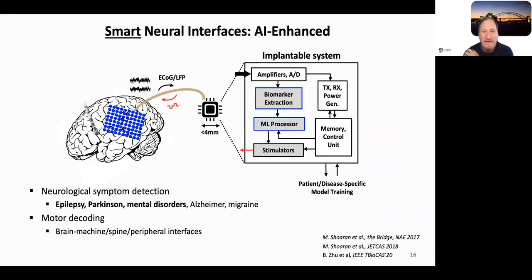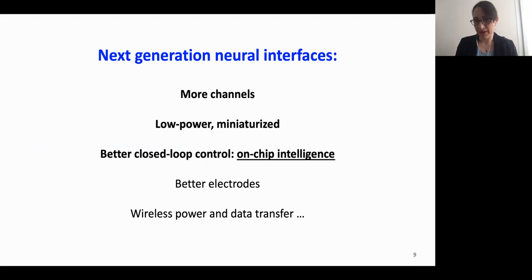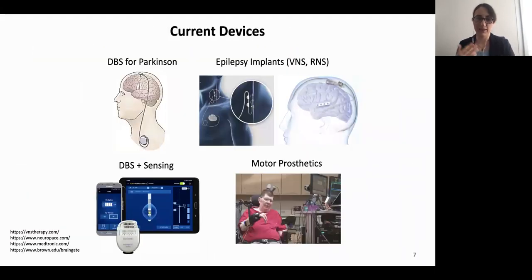What are the safeguards? Yeah, that's also a great question. Currently, battery powered devices with relatively high power consumption, as they're open loop like DBS, with large batteries, need battery replacement every maybe 3 to 5 years. So on one hand, we want to reduce the size of the battery, and we want to reduce the power consumption. For a device like DBS, the cutting edge research is trying to move toward a cranial implant rather than having a chest implanted device, which has complications with noise and the extension leads.